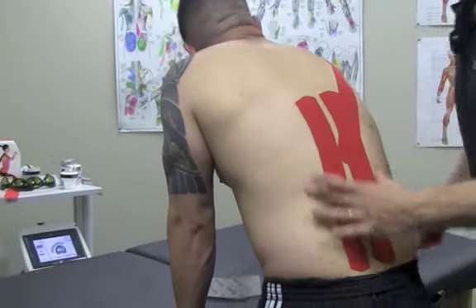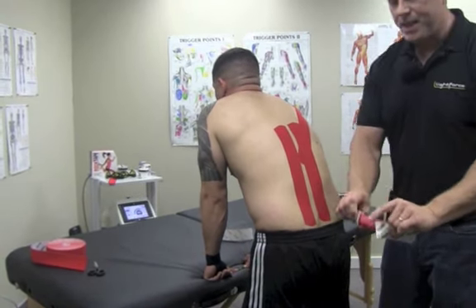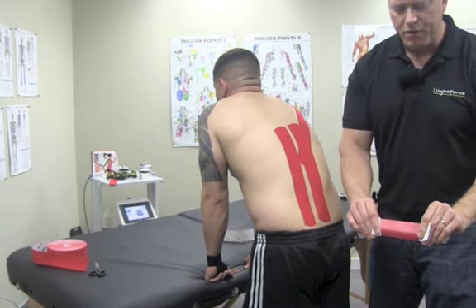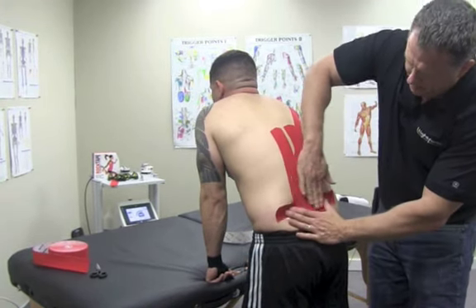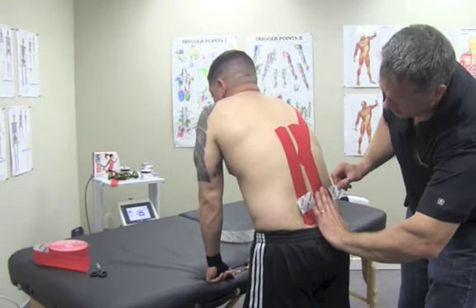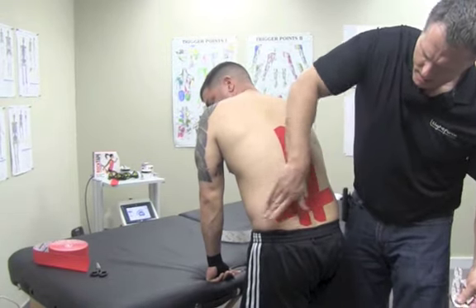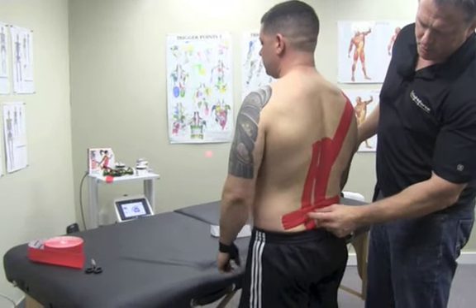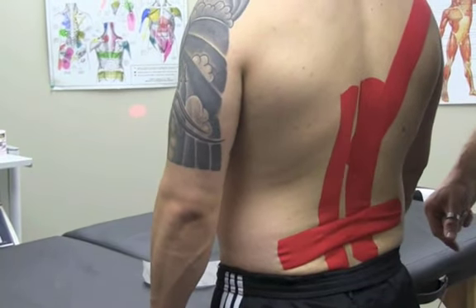So you've got your two stabilization strips, and now we're going to do decompression right around here. This one you always tear in the center. We're going to put a little bit more stretch in this one. I'm going to do 100%, back off 25%. Lay down the middle. So now that's going to really lift right there. Don't stretch the ends, just lay them down. And now when they stand up straight, you're going to see how the tape has a little bit of wrinkling in there, and it's going to give you a lot of stabilization into the back, so they feel more stable when they're bending over.